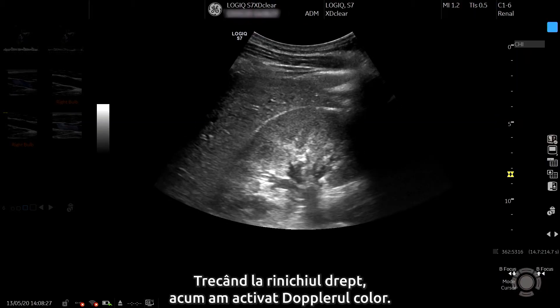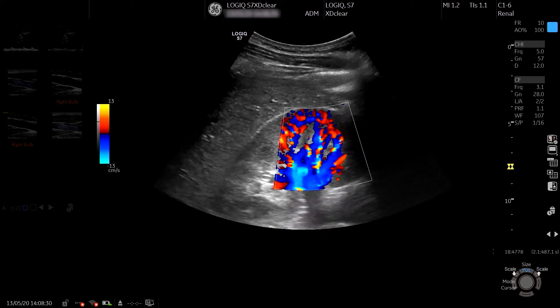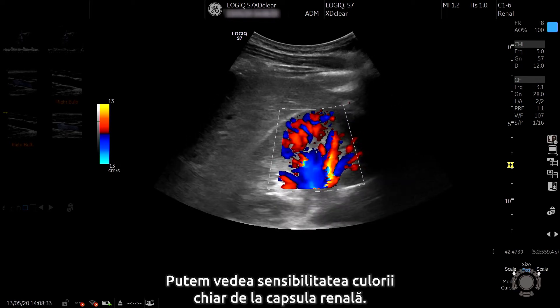Moving to the right kidney, we've now activated the colour Doppler. We can see the colour sensitivity right out to the renal capsule.